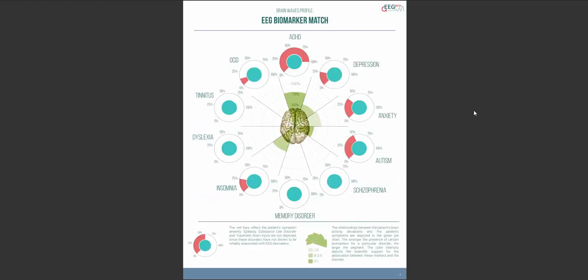The next page contains the so-called EEG biomarker match. This graph will give you information about the relationship between the degree of pathology as measured with the client questionnaire or therapist rating on the one hand and the deviations in brain activity on the other hand. The questionnaire or rating results are depicted in red and the deviations in brain activity are depicted in green. In this example, the patient shows a hundred percent score on ADHD for the questionnaire or rating and this matches the brain activity deviations rather well since the match with ADHD is about 80% for brain activity deviations.